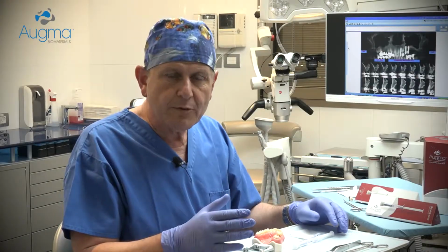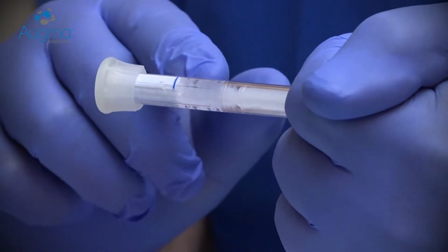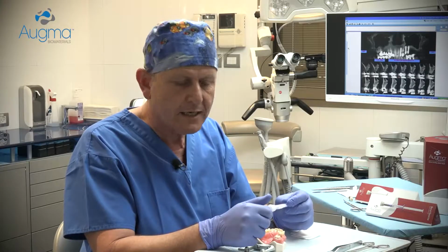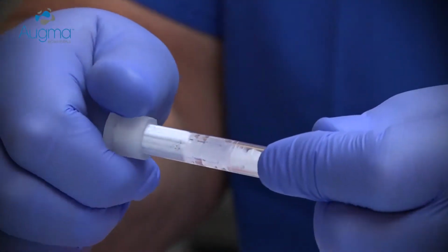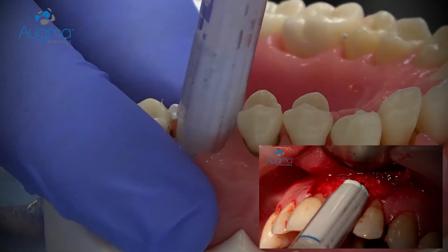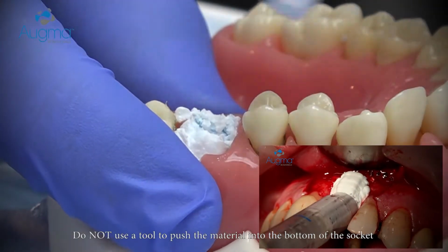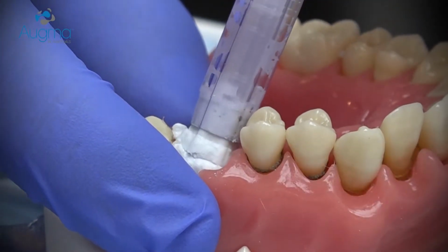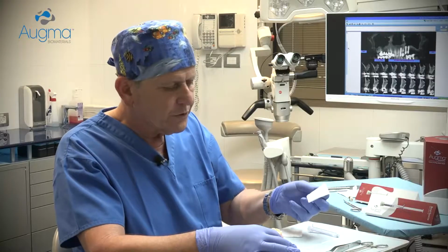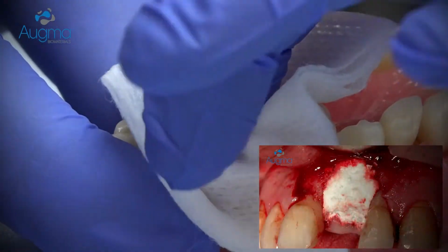Now, I would like to demonstrate how to work with Bond Apatite for the socket preservation technique when you don't reflect the flap. Press the shaft against the palm of your hand until the first piston reaches the blue line. Now the material is already activated. Remove the syringe head, approach the socket site and eject the material into the socket. Slightly overfill it. And now you take a dry gauze and press the material firmly into the socket.